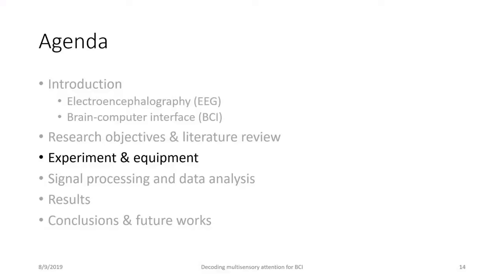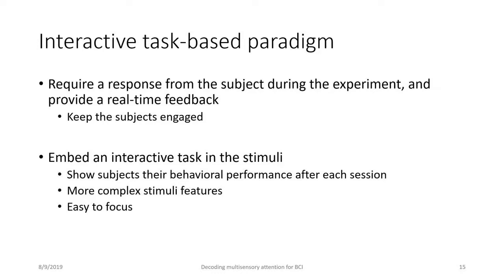And so with those in mind, I want to introduce my work, or my idea of how we can improve it. In most of the previous studies, we ask a subject to sit there and listen to the pure tone, and there are two different frequencies being played. They are woo, and you try to pay attention to that. That's the only task that they have to do.